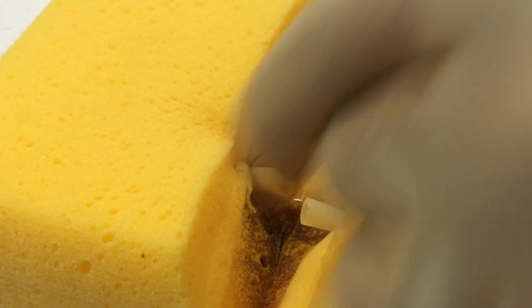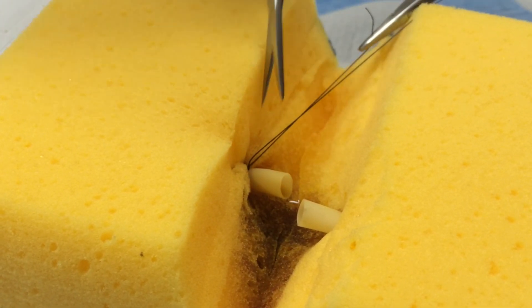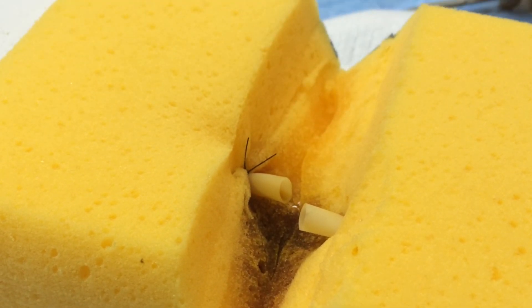When correctly performed, this type of suture should extrinsically compress the tissue surrounding the vessel and thus stop bleeding from the vessel.